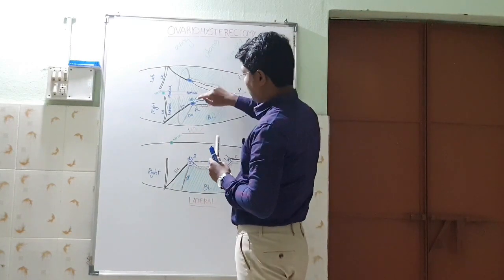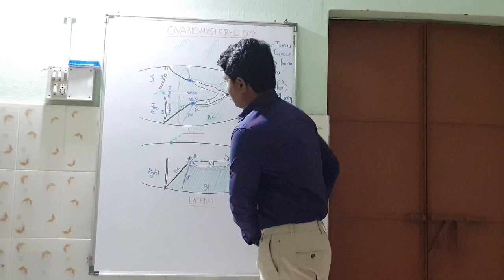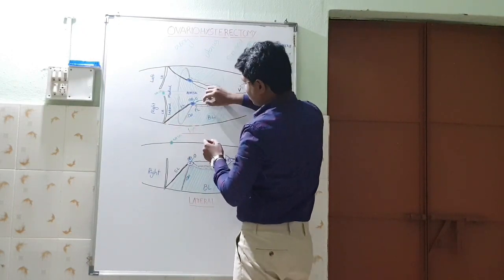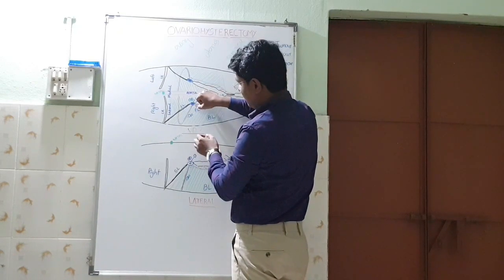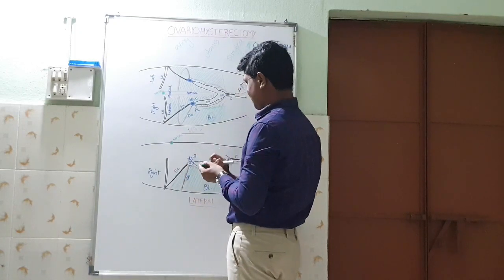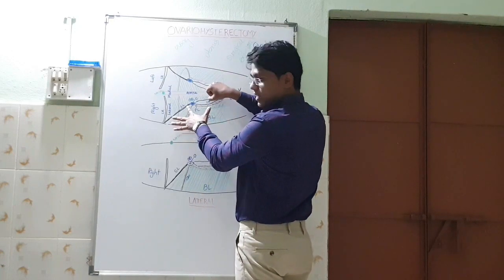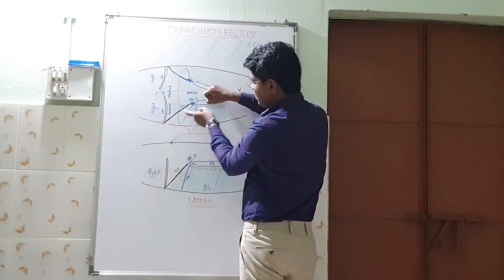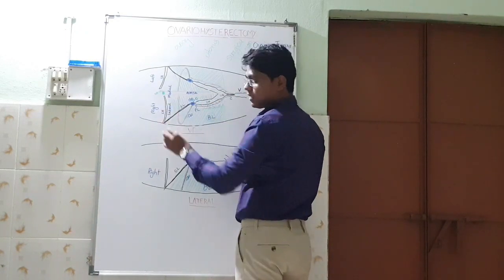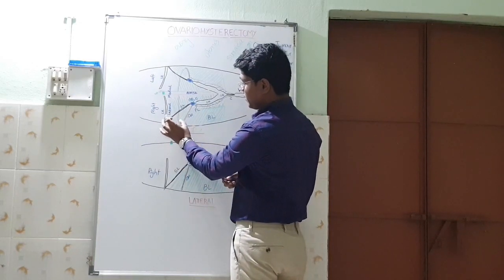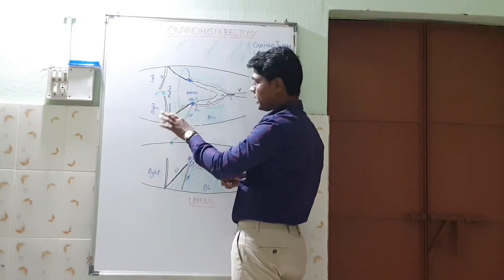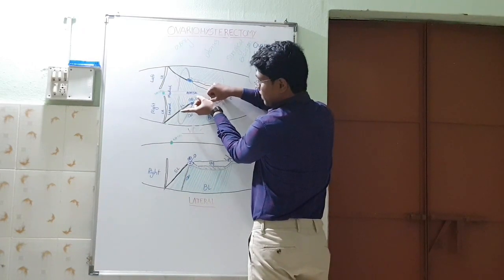How to rupture it? I have to break the right suspensory ligament. I will hold the proper ligament and pull it towards the caudal side — in the caudal direction. I will then slide my left hand index finger along the suspensory ligament towards the rib. You can clearly identify the thick ligament band versus the broad ligament membrane. I will pull the proper ligament caudal, then move my index finger a few centimeters away from the ovarian pedicle.